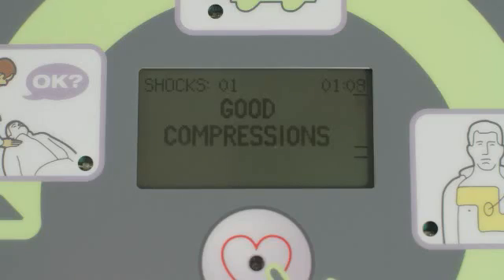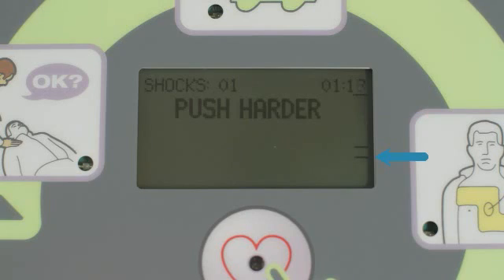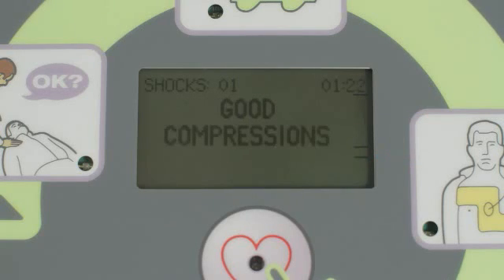The AED Plus will also give you a real-time display of each chest compression on the bar gauge. The upper line represents 2 inches, while the lower line represents 2.5 inches. Each compression should be deep enough to at least touch the upper line.